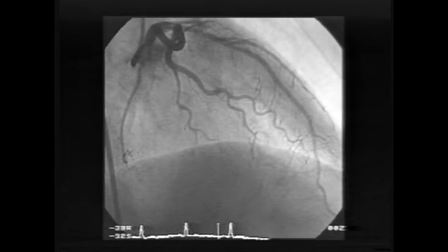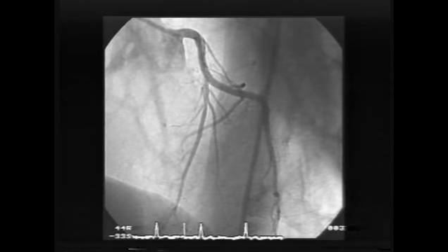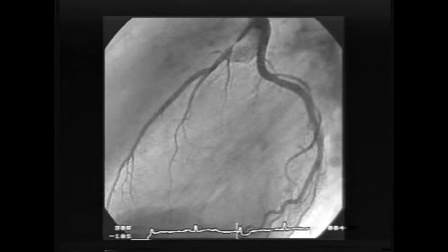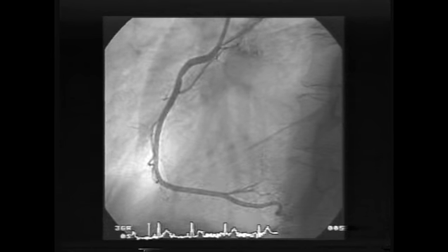Here we see a coronary artery being perfused with a radio-opaque dye, and we can see the coronary artery being illuminated to identify any possible blockages caused by atheroma into the lumen of the coronary artery. This illuminates nicely the anatomy of the coronary arteries. You can see an obstruction in that one there, it's quite thin.